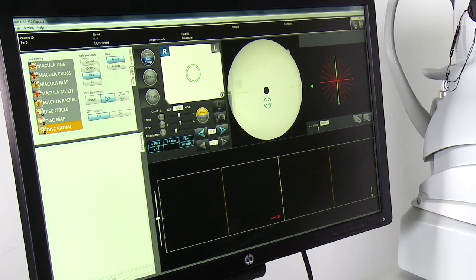It takes a little bit longer to capture a scan. Or you can go even further into ultrafine mode, which captures about 13,000 A scans per second and takes longer still. You will get very, very high resolution images with that, but also if a patient has some degree of lens opacities, it's much easier to get a series of good scans together to be able to actually assess their retina in more detail.